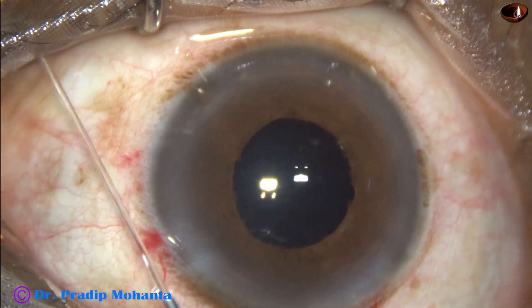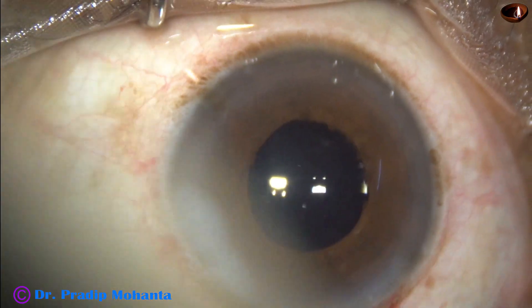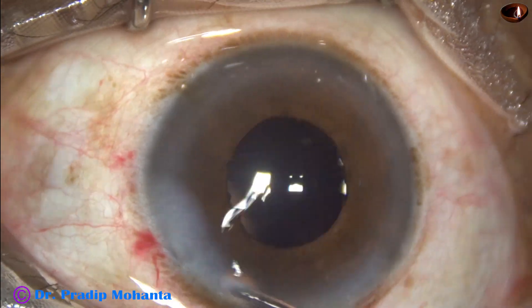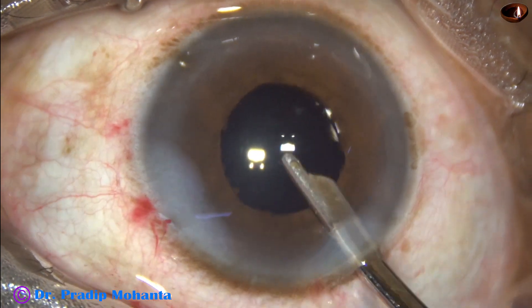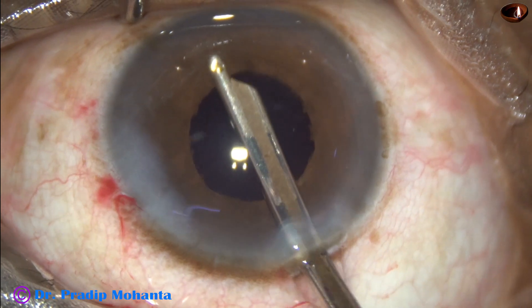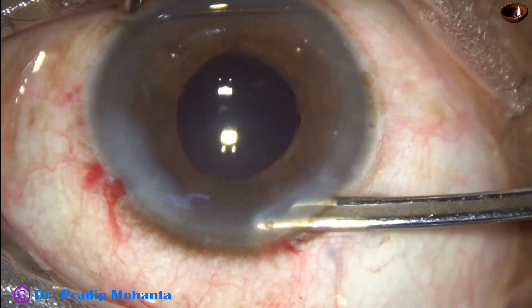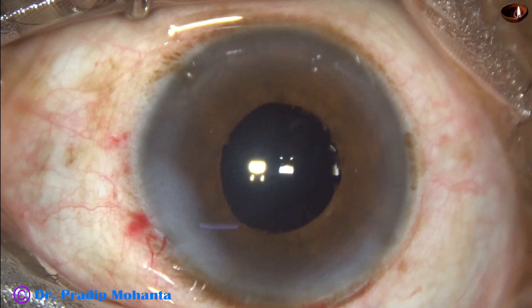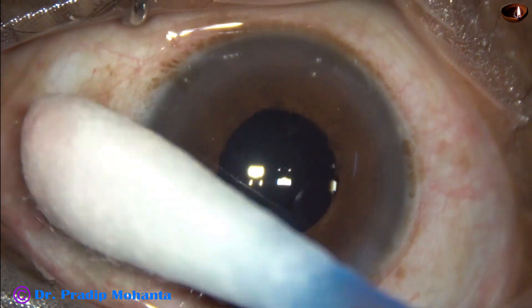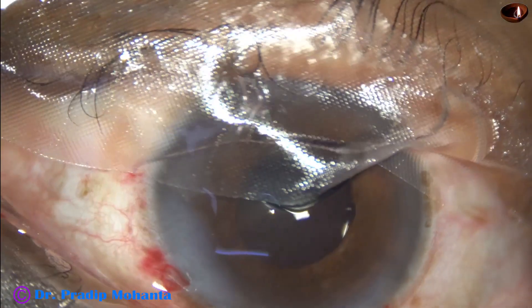This is moxifloxacin applied intracamerally. The side port is closed by corneal stromal hydration. Now this is the final lavage of the anterior chamber — I always do this, and I believe the incidence of endophthalmitis is almost nil in my practice because of this final lavage. Integrity of all the wounds is checked and a few drops of moxifloxacin are applied over the ocular surface. The case is concluded.